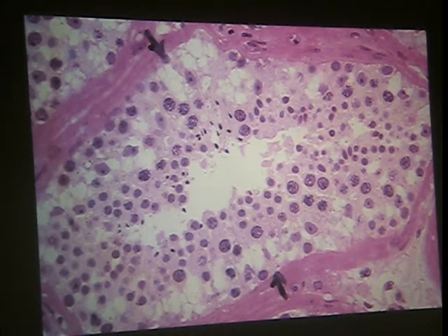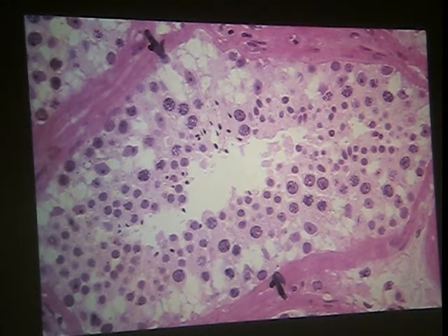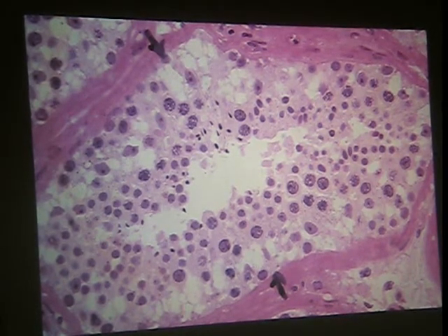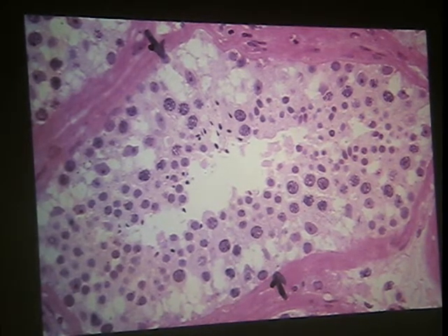The way you pick those cells up is basically by finding their nuclei. Because these are metabolically active cells that are cranking out things, the chromatin is euchromatic, which means it's light staining, except for the nucleolus. All right? That's in contrast to the spermatocytes. All they're worrying about is condensing, forming chromatids, condensing, dividing, that sort of thing.